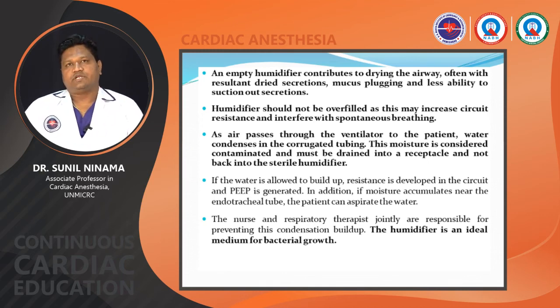It may cause resistance in the circuit and some flickering in the circuit. By that, you understand there is an obstruction to ventilation or the patient is not able to breathe. The nurse and the respiratory therapist are jointly responsible for preventing this condensation build-up. The humidifier is an ideal medium for bacterial growth.